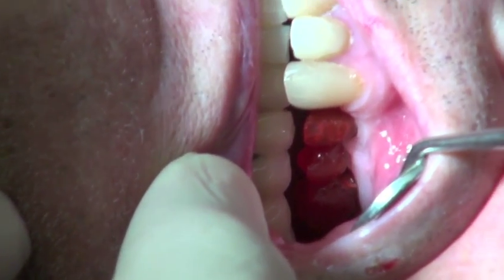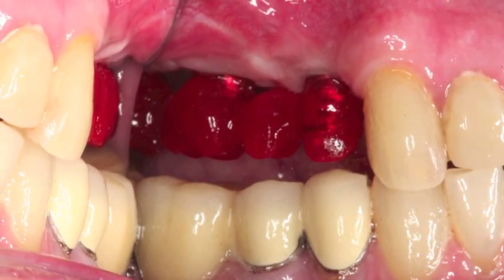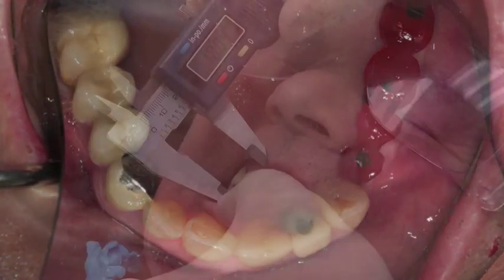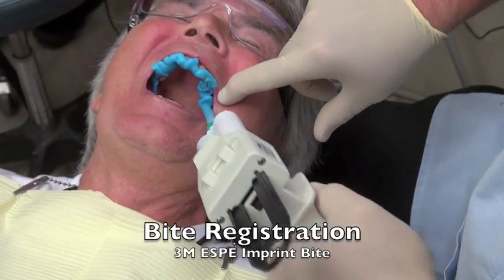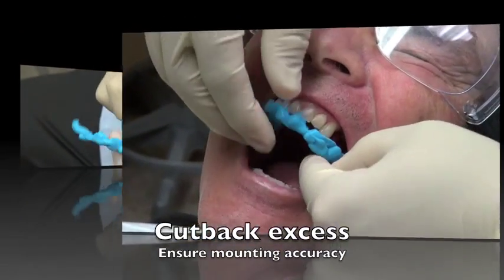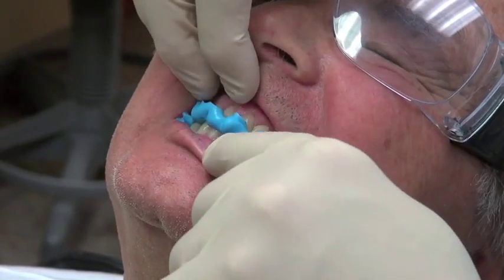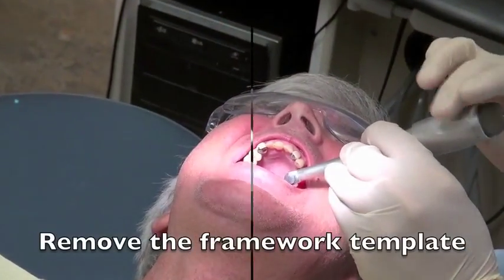We can also check the thickness of the porcelain by checking the patient's bite. This represents the zirconia substructure — the porcelain will be added on top. Once we take the bite, we can see that this is verified and everything is seated down nicely. I'm going to check the vertical now, making sure that before and after the bite registration we're at the same vertical so as not to change the bite. We're using imprint bite from 3M SP, then trimming it back with a scalpel to remove soft tissue rests. I verify this by putting it back in the mouth and checking the vertical again with a caliper to ensure the gingival markings will be accurate.